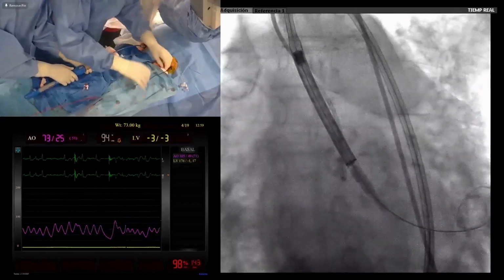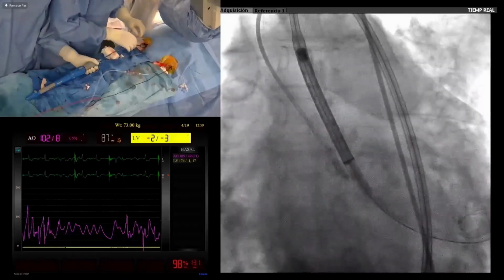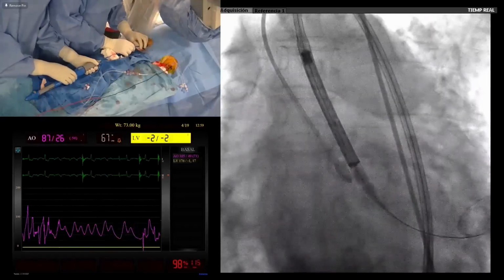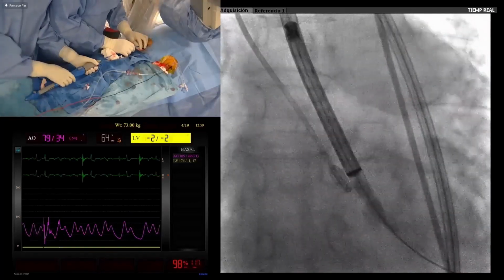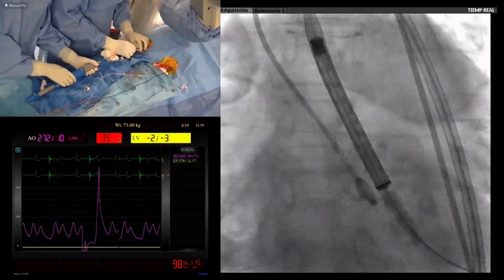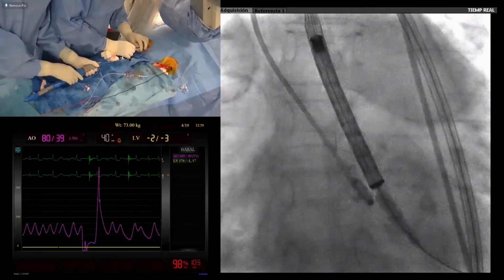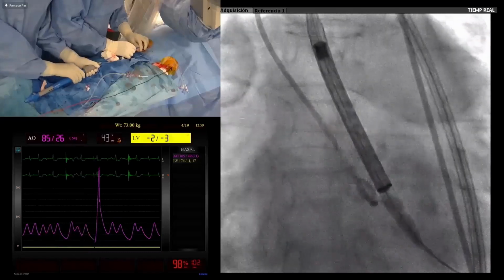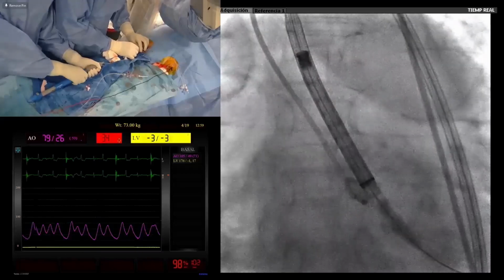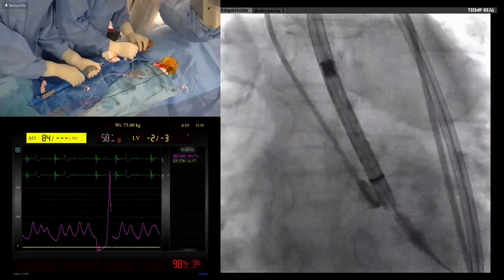Wait a minute. Let's reposition the pigtail, which is torqued around the valve. Now it's better. Let's zoom a little bit. It's much better. So let's test. Okay, we can start now. Dr. Fava is starting. I will prevent any movements. We'll try to be at 0 or 1 or 2, not that much. Test. Be prepared for 120.